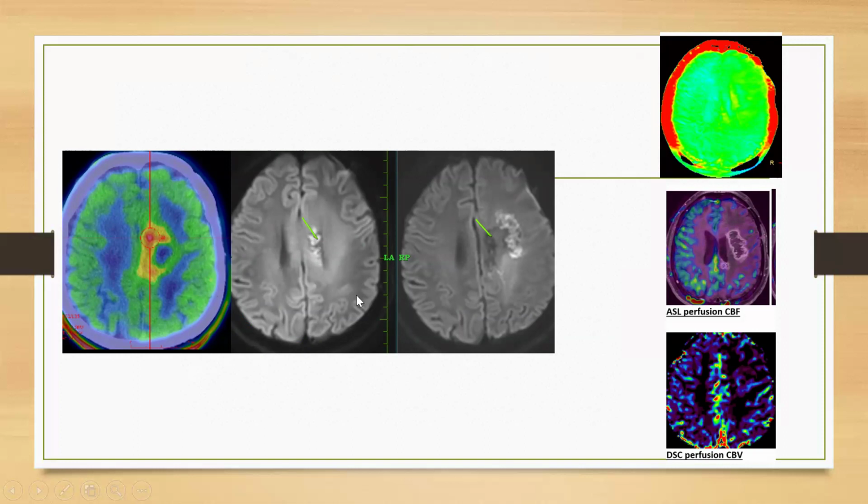And this is also an international patient. An FDG F18 scan was done, and it showed high uptake, and it was thought to be tumor at an outside center.